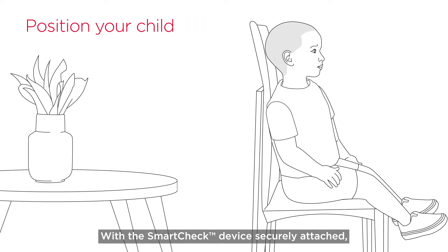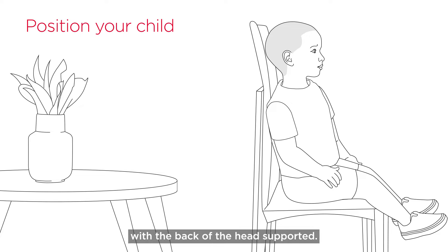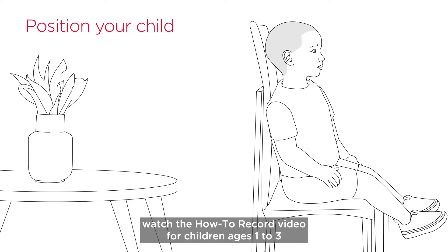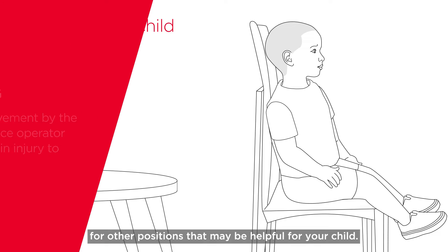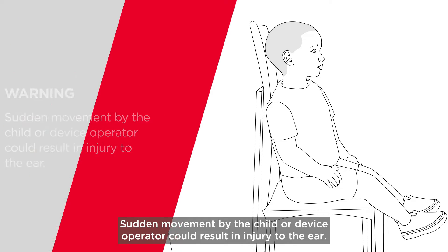With the SmartCheck device securely attached, position your child sitting upright in a comfortable place with the back of the head supported. Ask your child to stay as still as possible. If they have trouble sitting still in this position, watch the How to Record video for children ages 1 to 3 for other positions that may be helpful. Sudden movement by the child or device operator could result in injury to the ear.